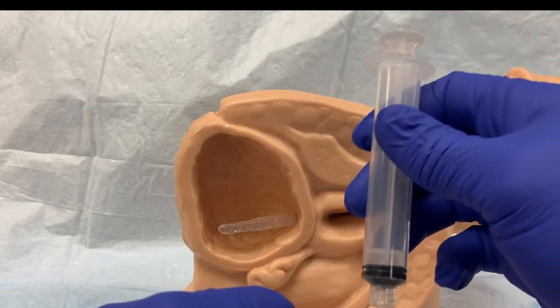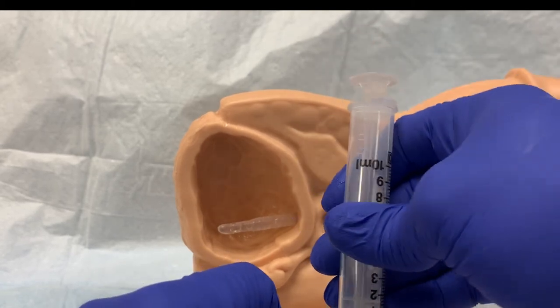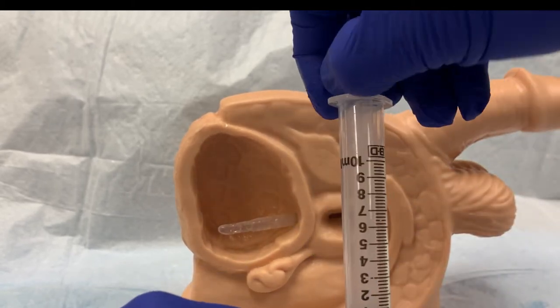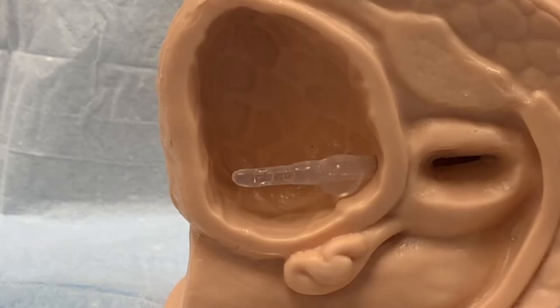When the appropriate amount of fluid has been removed, just to ensure the balloon is empty, attach another empty syringe to the port and make sure nothing else comes out of that balloon. If any fluid is left in the balloon when you attempt to remove the catheter, there is potential to cause significant damage to the urethra.